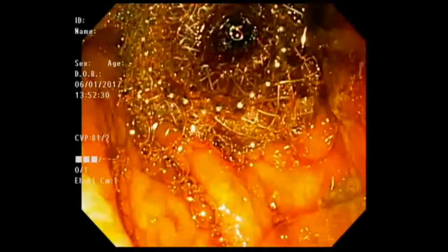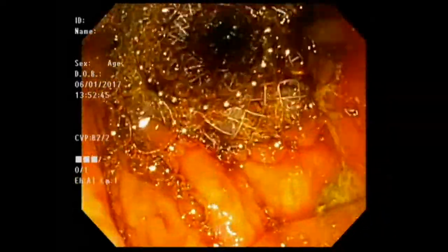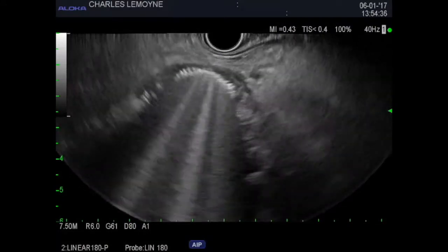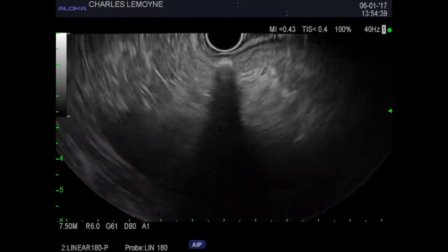Here is the endoscopic view of the maneuver. We can clearly see dark bile flowing out of the stent. Here is the EUS view of the fully deployed lumen-apposing metal stent.